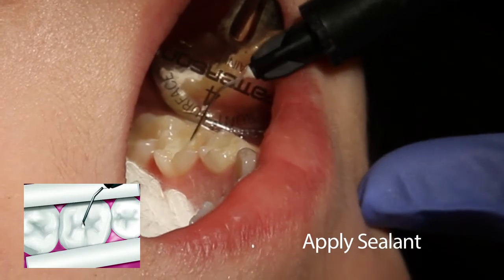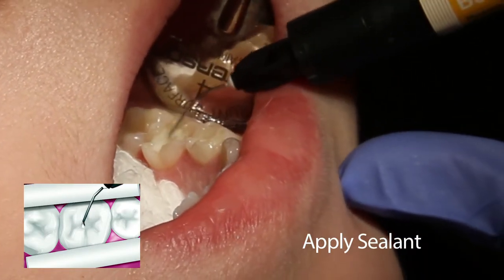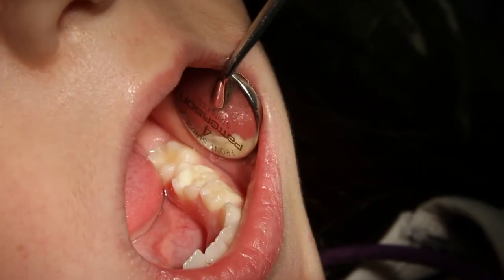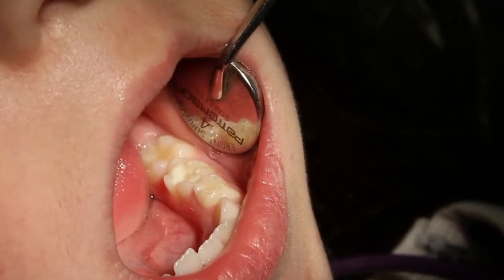As it is applied, you will notice the primer drawing the paste deep into the pits and fissures, allowing you to get a precise application. As you can see, Beauty Sealant is white, giving your patients and their parents the assurance that the material is in place and intact.